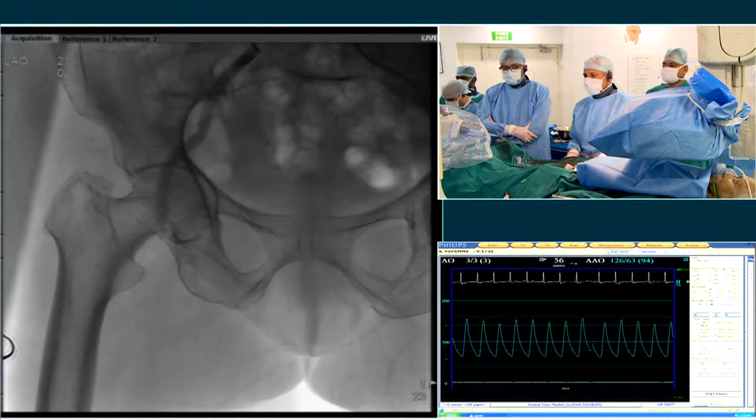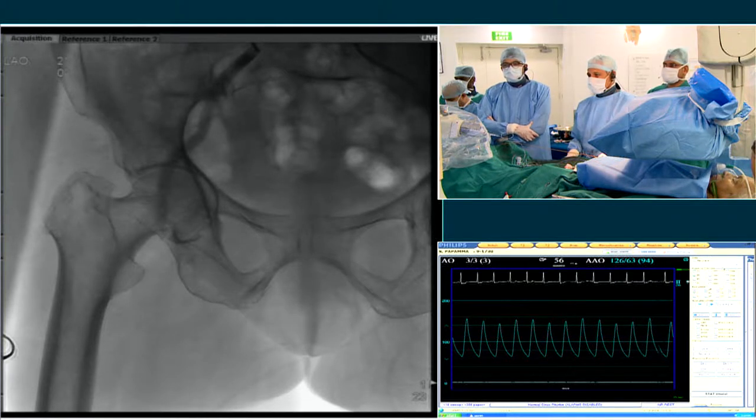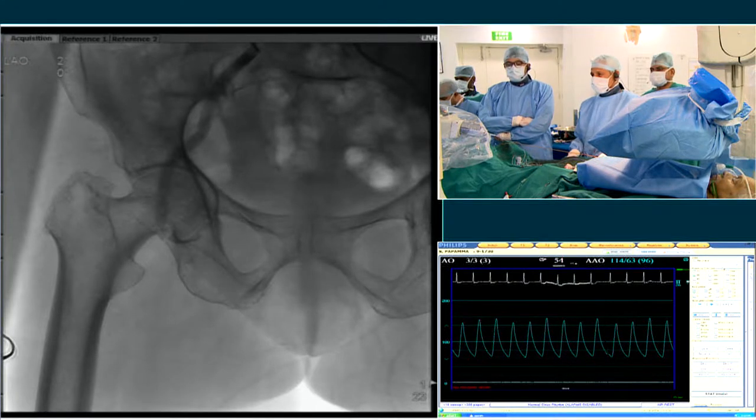Could you also talk briefly about the fact that this is a bicuspid valve and your valve is probably going to end up in an eccentric position in the annulus and not completely in the middle, and concerns with low coronary height with the bicuspid? Absolutely. It's a very valid point. When we look at the CT scan.